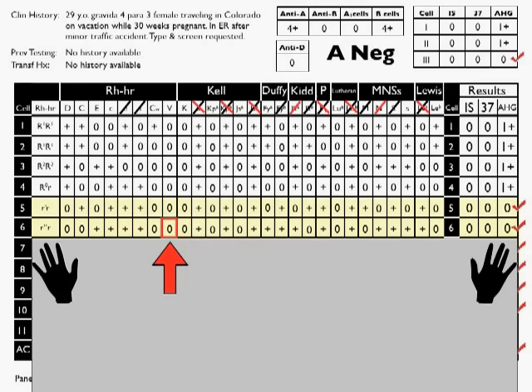Nothing for V, nothing for CW, single slash for f, little f that is. No slashes for either big E or little e because both have single dose expression. And then finally, a single slash for little c because it's double dose, and nothing for big D.